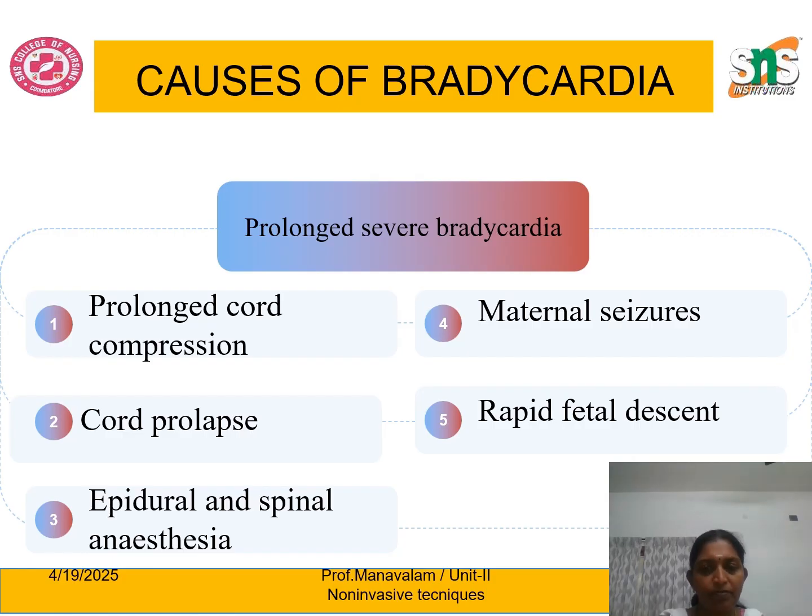Next, rapid fetal descent. Actually this process normally takes place slowly, progressing stage-wise. But instead of going stage-wise, a sudden or rapid fetal descent may occur.